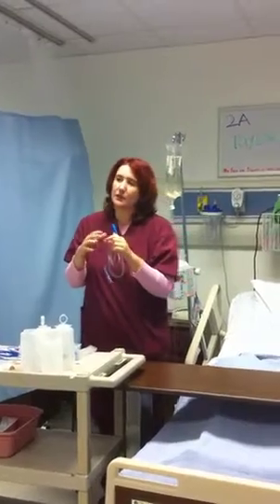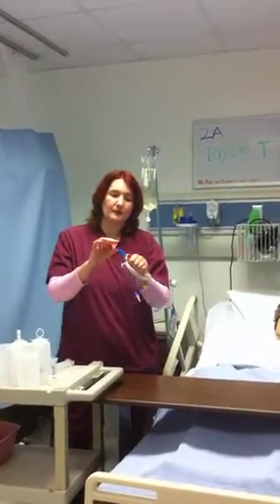So it's usually not an ideal choice or the best choice for feeding, because the tube after insertion has to be connected to an adapter and then to a feeding pump. So you may have a bit of difficulty finding the right adapter, but it's very easy to insert.